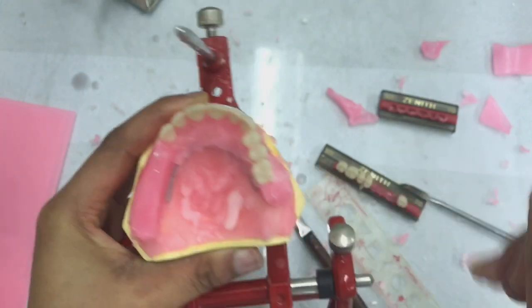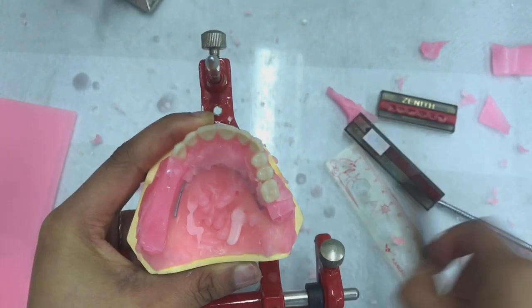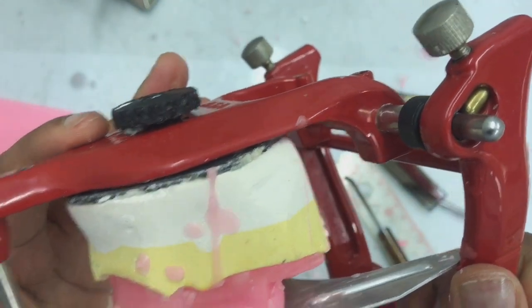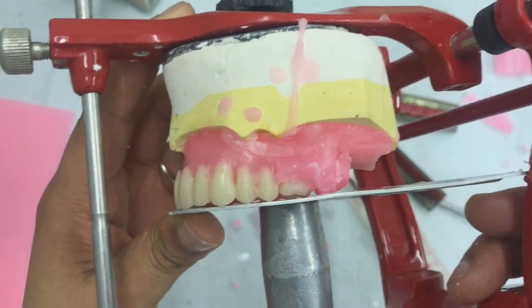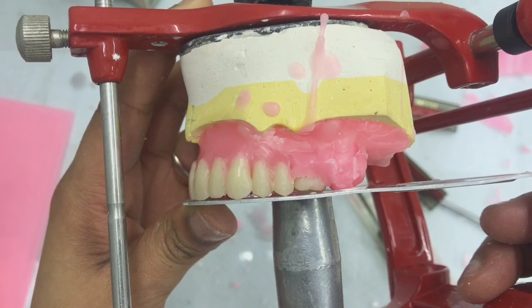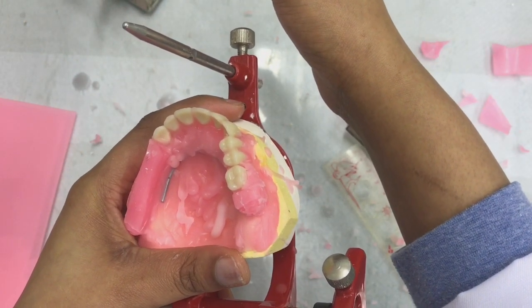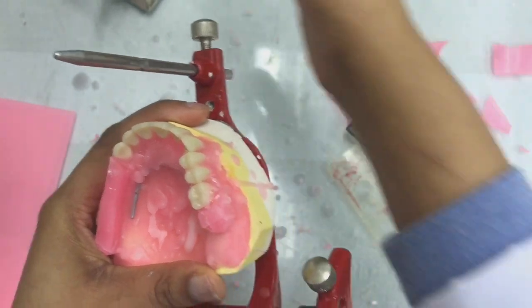I'm placing my tooth again, trying to maintain that imaginary line. And what I want is for this cusp here to be on the occlusal table whilst all the other cusps are off the table. So let us see. Okay, currently can you see that both the mesiolingual as well as distal lingual cusp are on the table. So what I need to do is get the distal lingual cusp off the table. So I'm just going to melt the wax around the tooth so that I can facilitate some movement taking place.